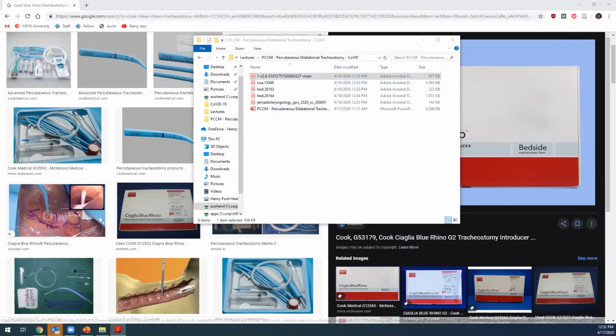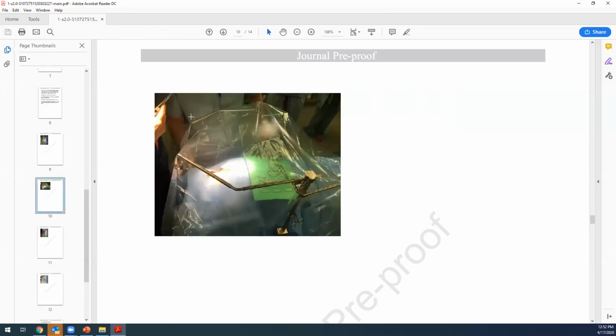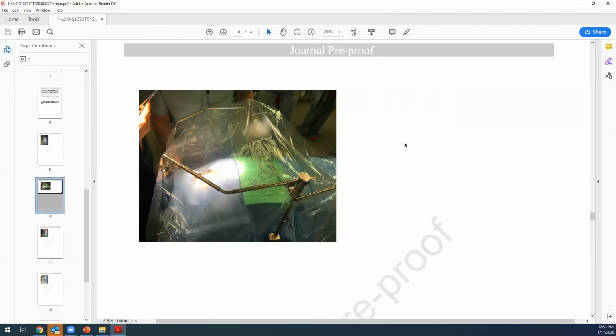There is one study, let me see if I could find that, that basically created their own negative pressure chamber, as you can see here. They placed these V-shaped clamps, placed a drape over here, and inside they have two suctions that are connected to HEPA filters. And then they do the tracheostomy while standing here. You can see the operator standing here, hands under this drape itself, and performing the tracheostomy to minimize aerosolization that takes place within this chamber itself. It's something we could think about when we get down to these details.